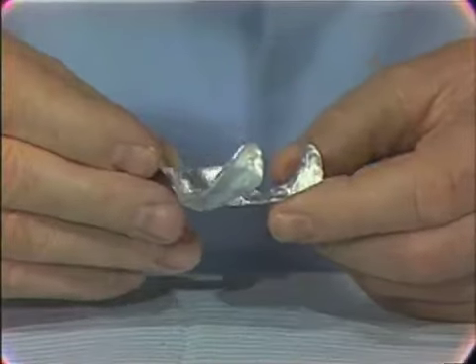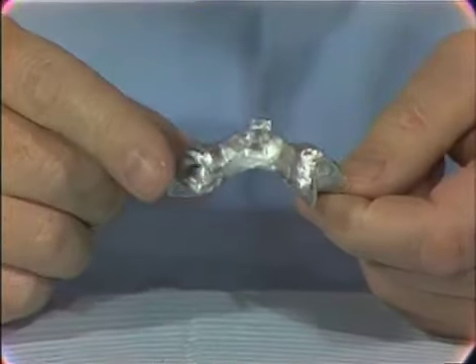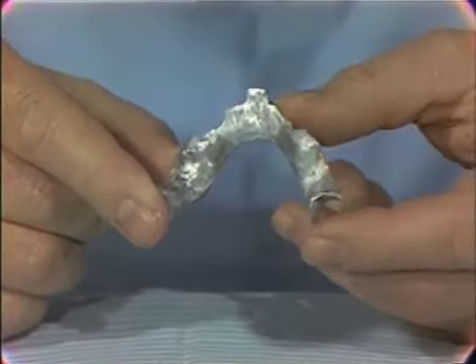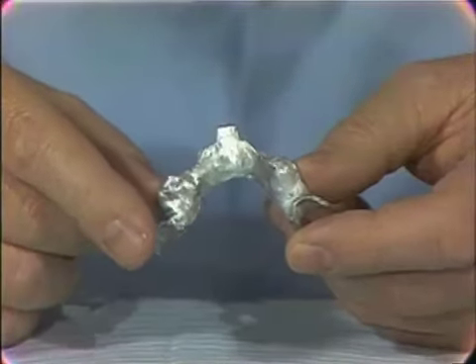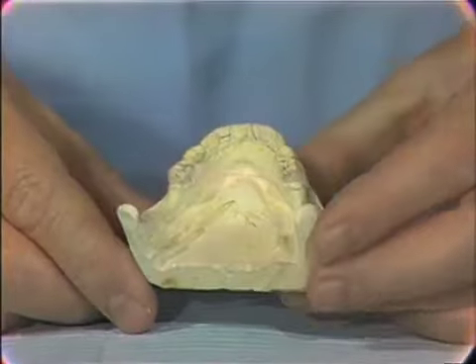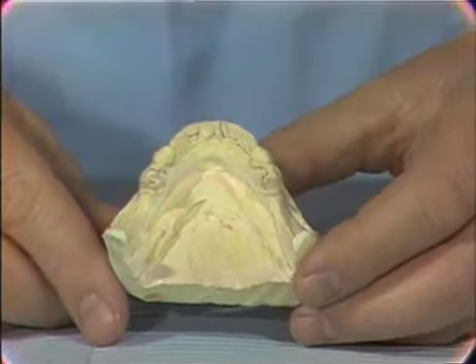So the impression tray has certain requirements. We can meet these requirements best for a mandibular tray by using cast aluminum, and this is a cast aluminum mandibular impression tray. This impression tray is made from a model of the mouth. This is an alginate impression from the mouth. It's an overextended impression, so we would like to fabricate a tray from this impression.